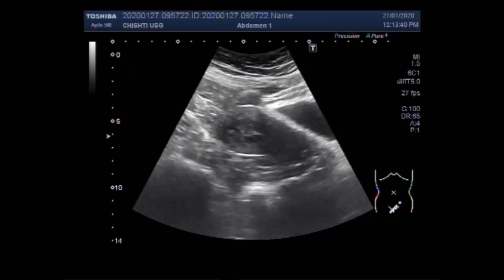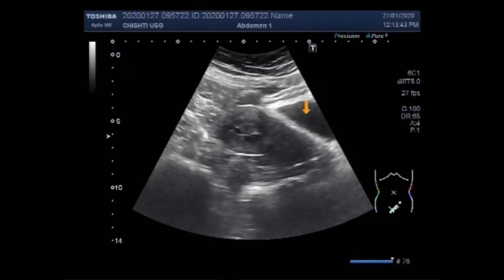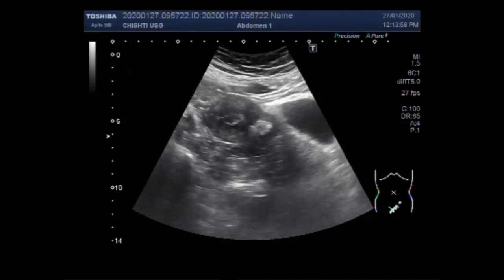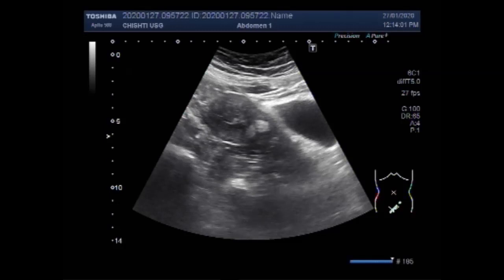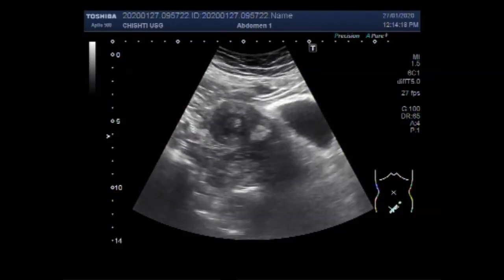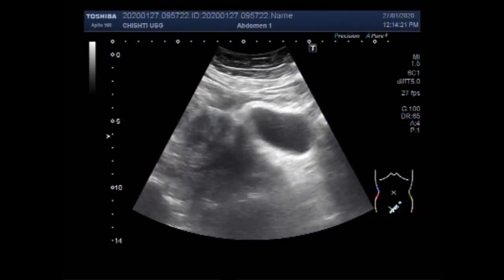Now we are going to see another case of fibroid uterus. You can see the urinary bladder, uterus, and cervix. There are two small masses attached to each other, lying near to each other in the proximal portion of the uterus, near the cervix. It looks like the masses lie in the middle portion of the uterus.